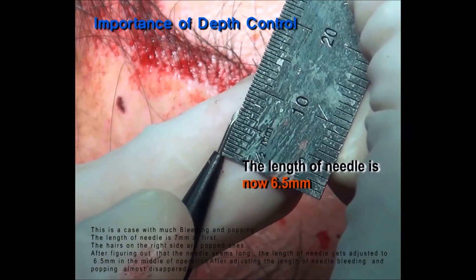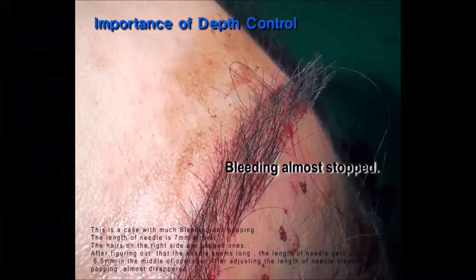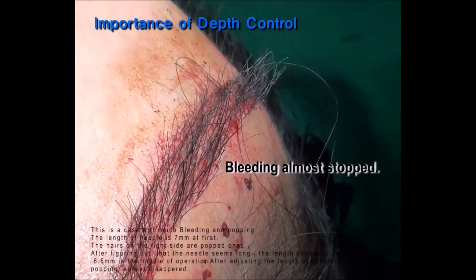After adjusting the length of the needle, bleeding and popping almost disappeared.